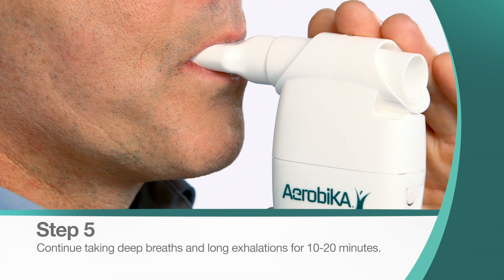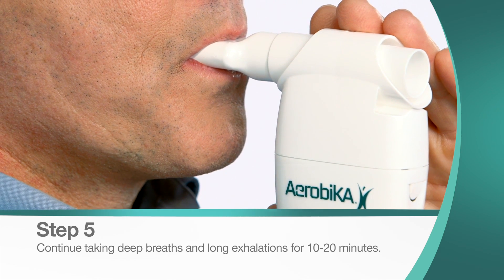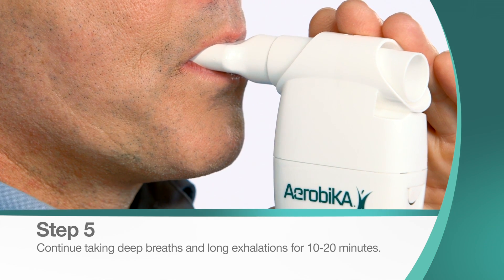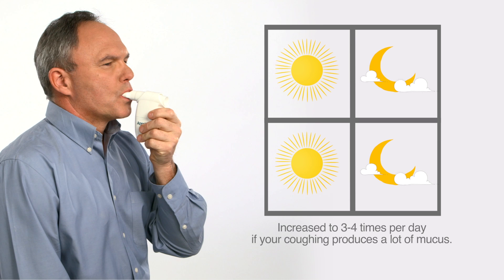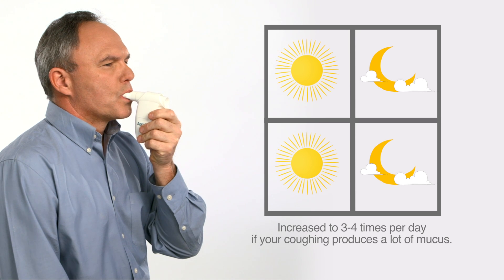Continue this cycle for ten to twenty minutes, or as prescribed by your health care professional. Treatments should be performed twice each day, and increased to three to four times per day if your coughing produces a lot of mucus.